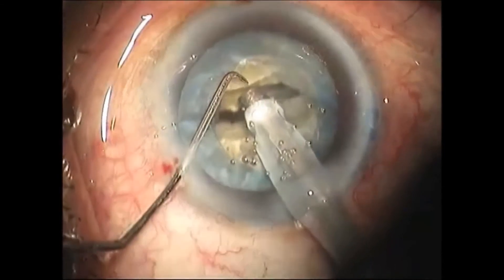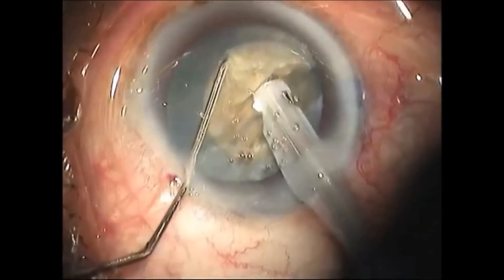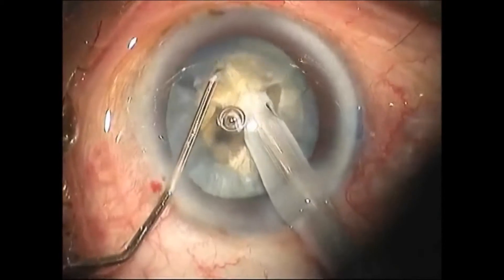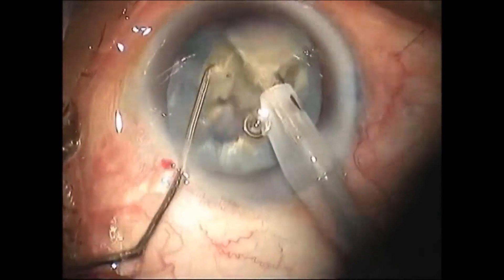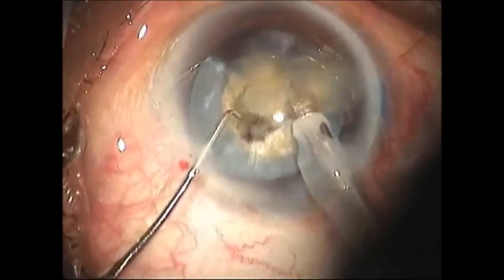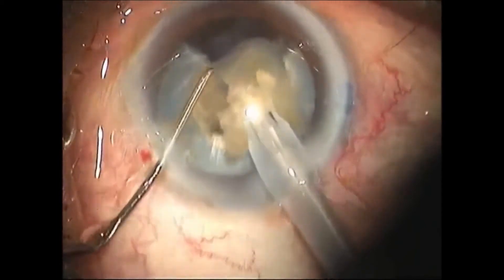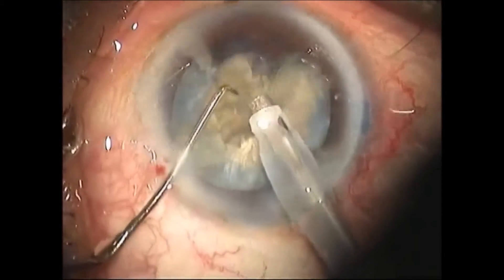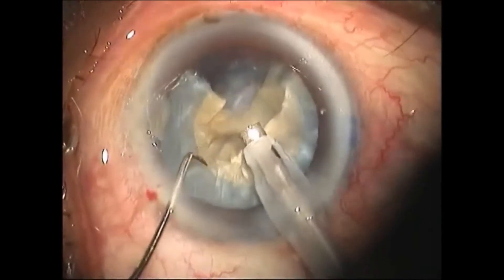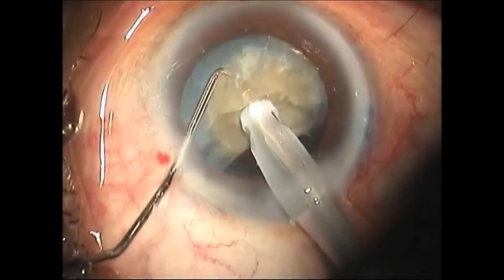In phaco mode 2, the nucleus is held and chopped into pieces and removed with a sharp chopper — the smaller the pieces, the easier the nucleus removal. The hold of the nucleus should be at the posterior part of the nuclear core; if held anteriorly, the chances of losing grip are more common.